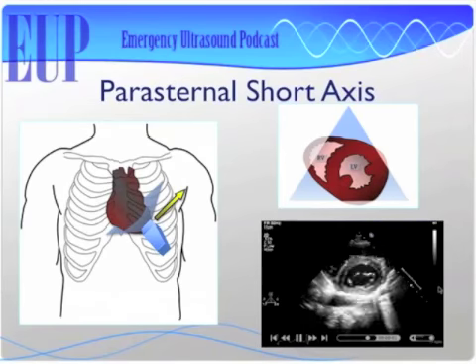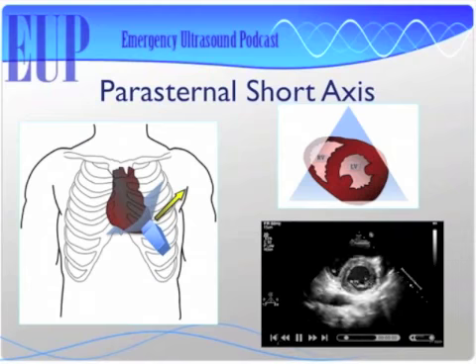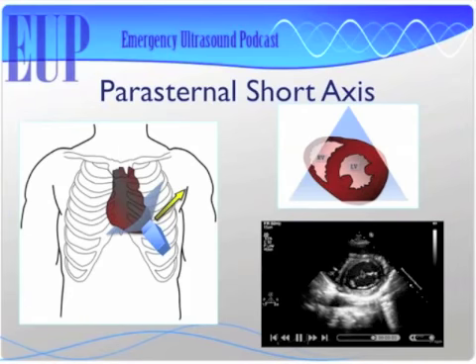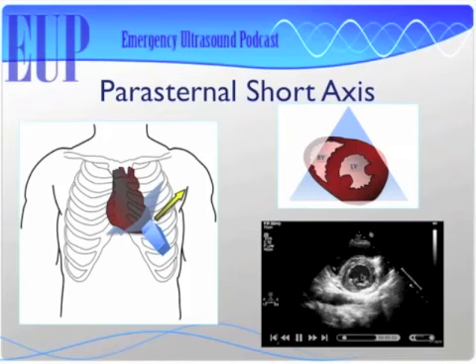Is there a fish in that heart? Yeah, there is actually a fish in the heart. So nice to point out. That's the mitral valve right there in the center that's flapping open. So that's the fish mouth view we talk about sometimes. And this shows good squeezing of that left ventricle. Everything's squeezing toward a central point, which you would expect.